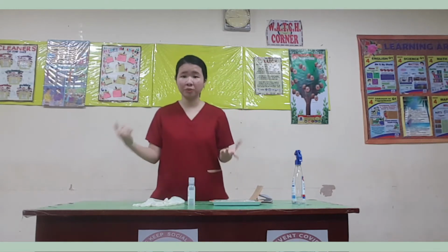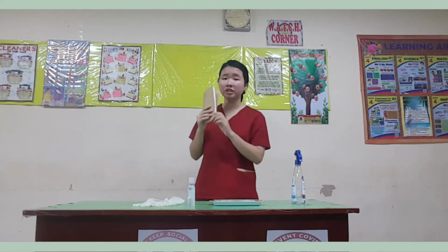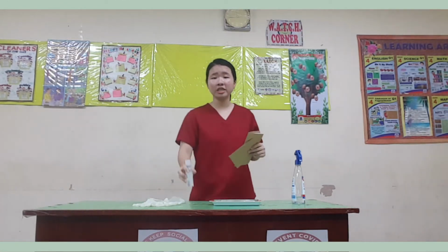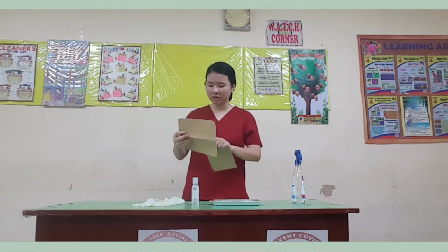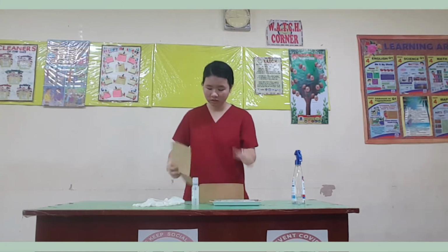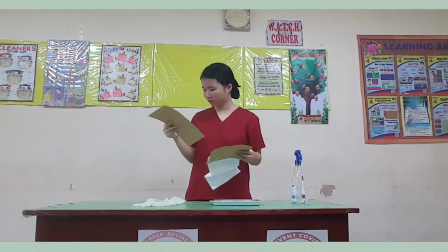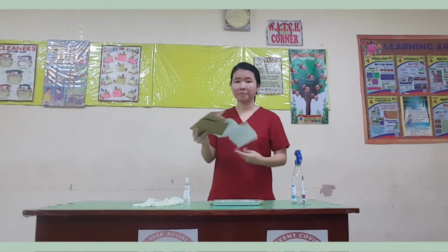So let's proceed to procedure number 5, which is to compare doctor's orders with the medication ticket and the medication ticket with the medication itself. This is to ensure that the right medication is to be used and to avoid any errors while administering. Now going to check it. This now confirms that they are all in uniform.